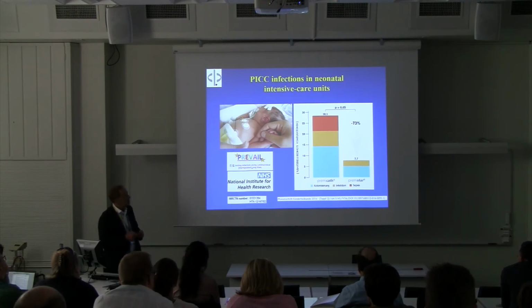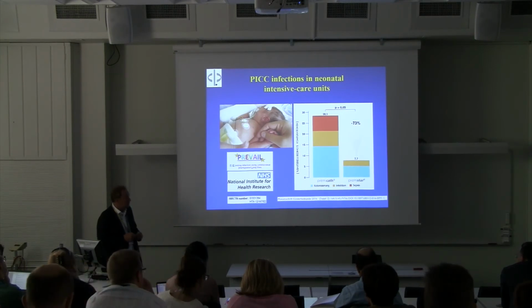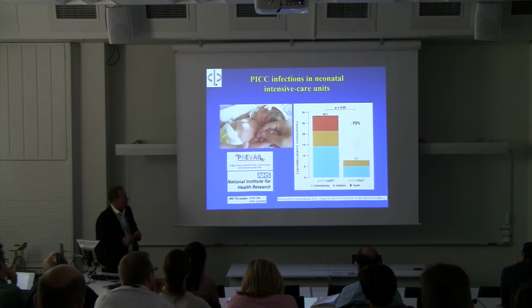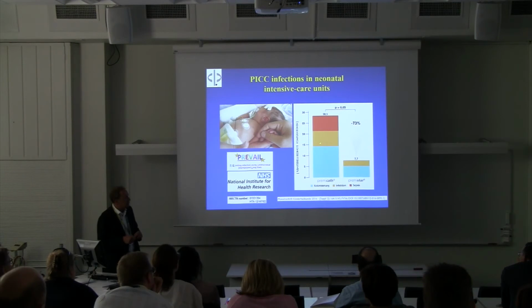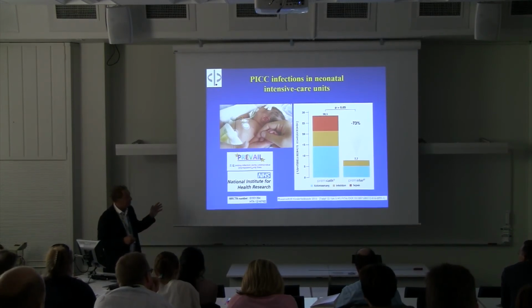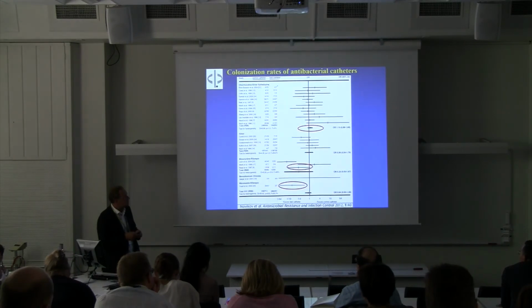And maybe we are getting some bloodstream infections, but the pilot study performed by Dr. Flemmer 2 years ago in Munich could clearly show that we have no cases of sepsis, some cases of infection and some colonization, but in summary, a significant reduction of any infectious event. Now, hopefully, the results of the NHS trial are positive. I think we are getting the results this year.